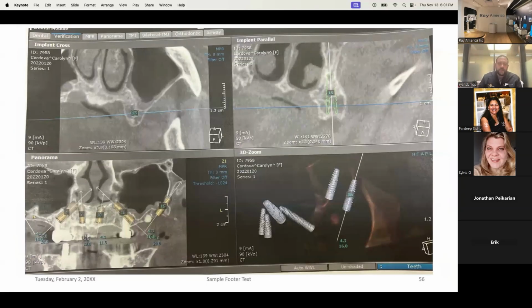This is the contralateral pterygoid. So again, looking for the pterygoid, the tuberosity volume, and then using that kind of like a funnel to go up to the pterygoid plates and engage the dense pterygoid bone. You can kind of see on the medial aspect of this scan where the greater palatine artery is and how it courses up along the sinus wall past the apex of our implant.